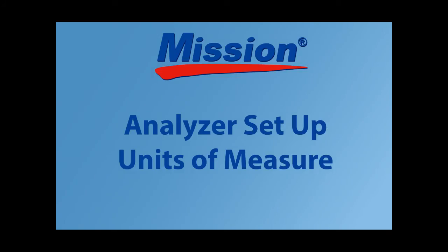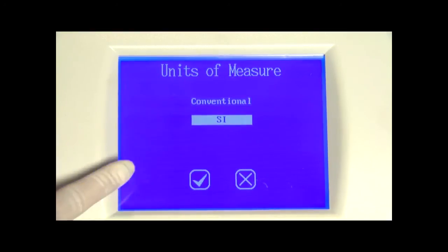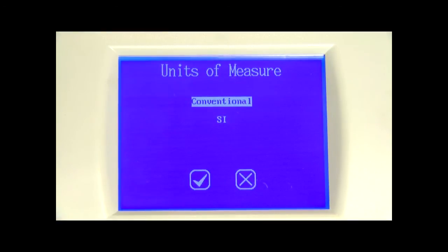From the main menu, press the units of measure icon to select units of measure. Press either conventional or SI to select the desired unit — the selection will be highlighted. Note that arbitrary results will be printed automatically regardless of the unit setting. Press check mark to accept the changes and return to the main menu, or press cross mark to return without any changes. If user login is enabled and operator ID is 11 through 20, the operator can only view settings.